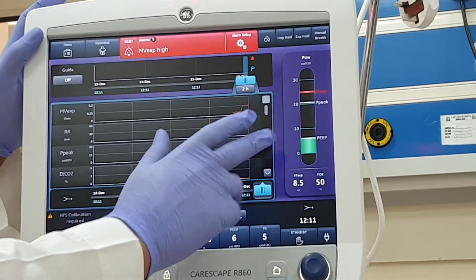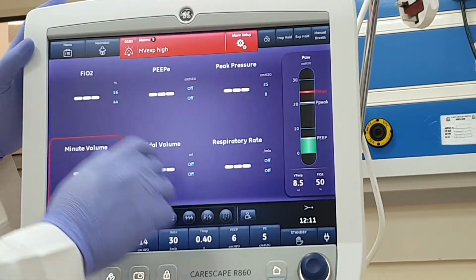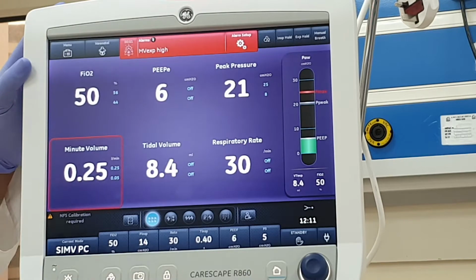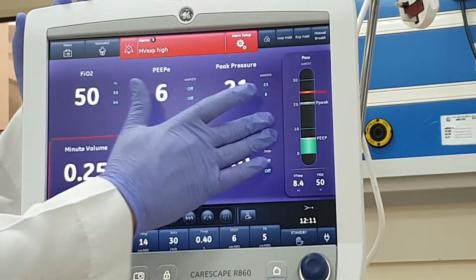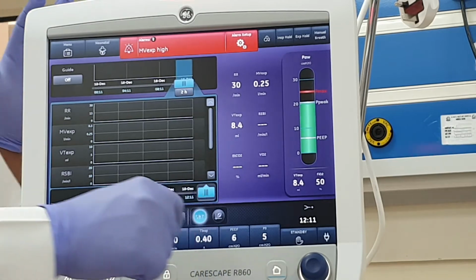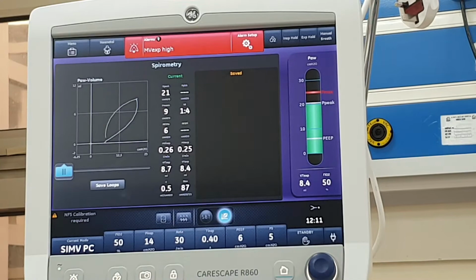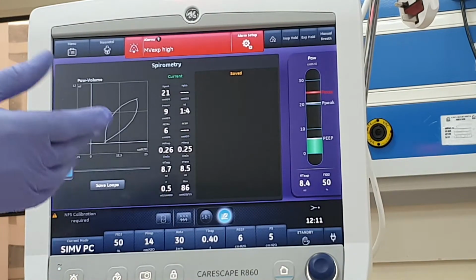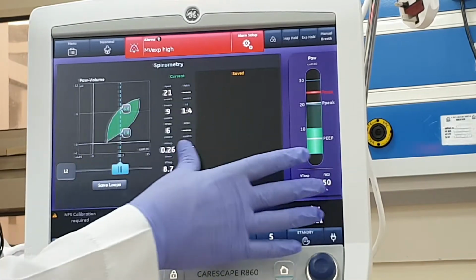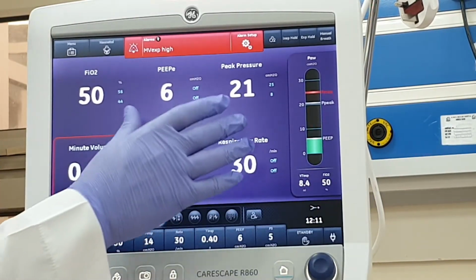Okay, yeah. So you swap it from the right to the left, and you do have your measurement, which is the present. You want to go to the future, you swap it from the right to the left, and you will go to the future, which is your SPT measurement, and also your loops. If you want to go back, you could go back by swapping from the left to the right.